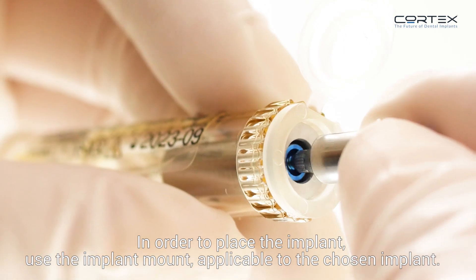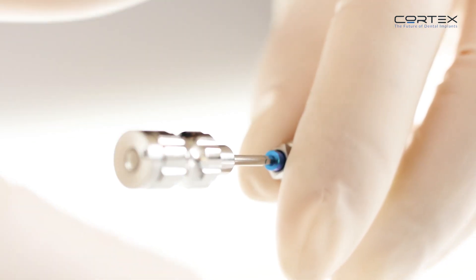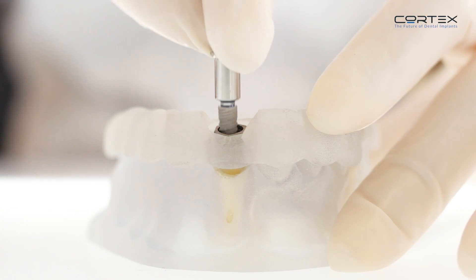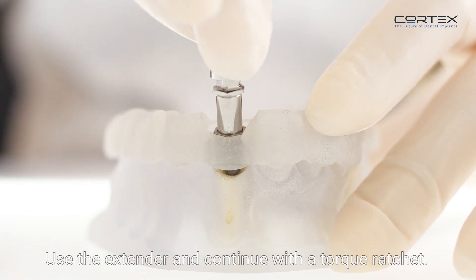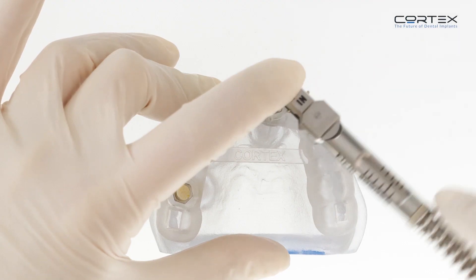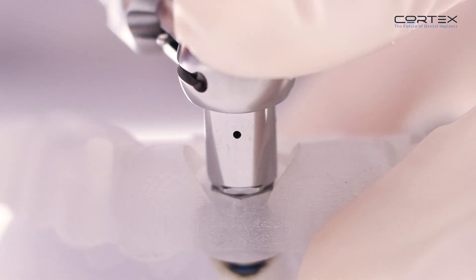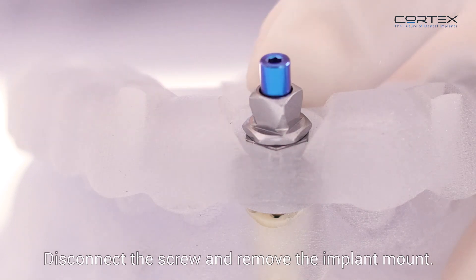In order to place the implant, use the implant mount applicable to the chosen implant. Use the extender and continue with a torque ratchet. Hex orientation is correlated to the implant. Disconnect the screw and remove the implant mount.